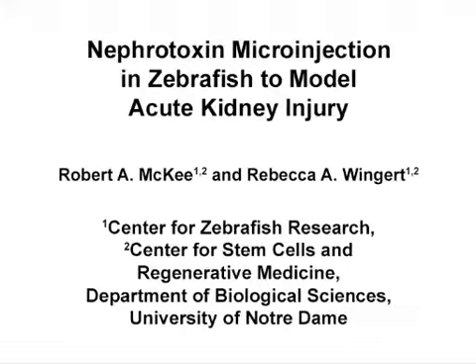The overall goal of this protocol is to use zebrafish to observe the effect of nephrotoxins, such as gentamicin or cisplatin, to model acute kidney injury. The main advantage of this technique is that the zebrafish model enables real-time imaging of cell damage and regeneration after acute kidney injury.